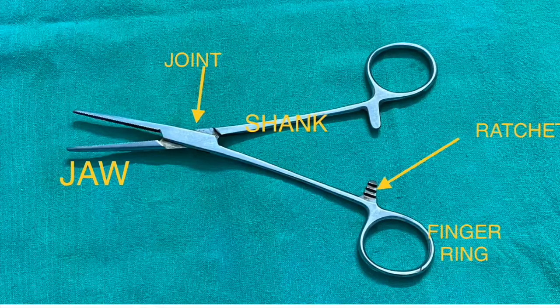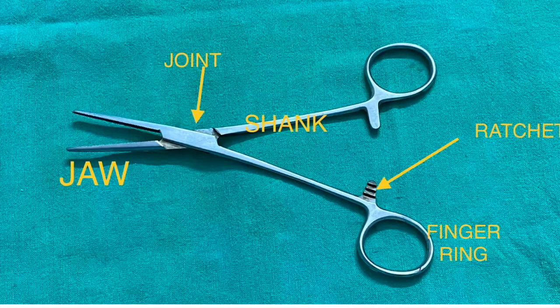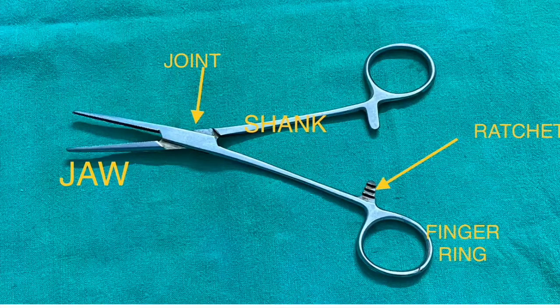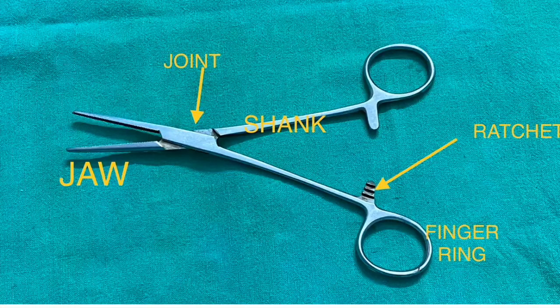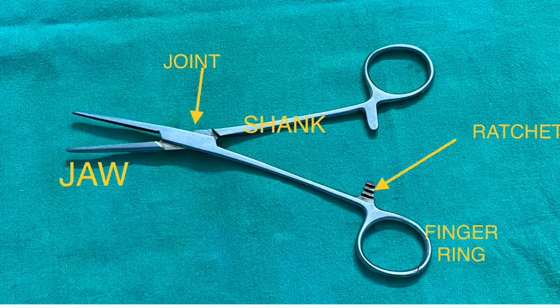If you take any kind of instrument, these instruments can be labeled as jaw, joint, shank, ratchet, and finger grip. In most blunt instruments you can call it the jaw; in sharp instruments we can call it the blade. The next part is the fulcrum, which is the joint, and it comes in two variants.